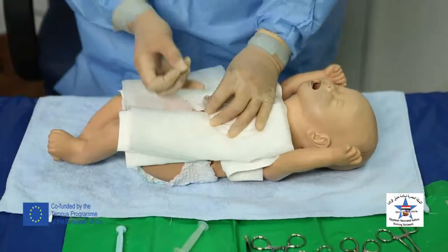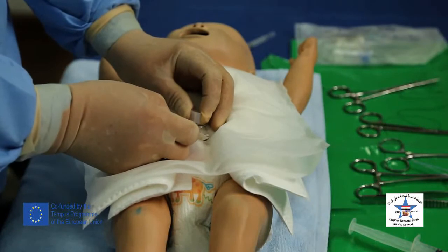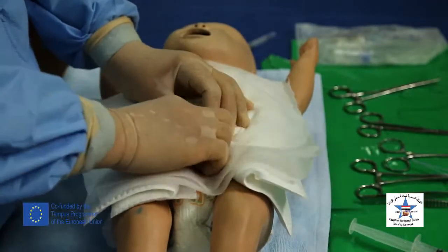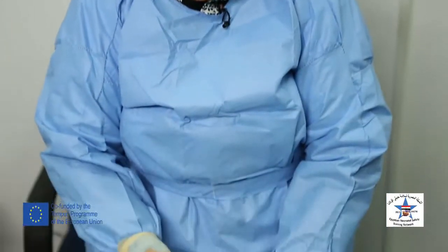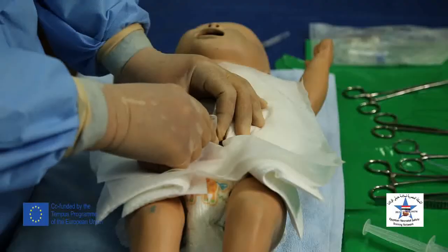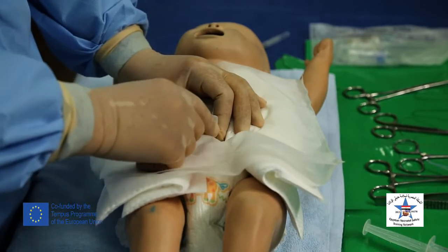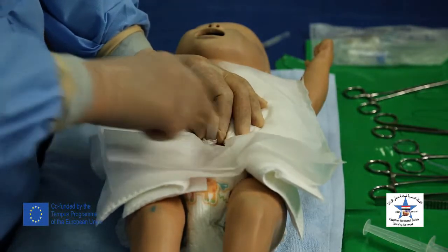And with the knife, cut the umbilical cord 2 centimeters from the abdominal wall. Identify both vessels, artery and vein, at the cut umbilical stump. Usually the vein is thin-walled and widely opened, located at approximately 12 o'clock position. The 2 umbilical arteries are thick-walled, pinpointed, protruding from the umbilical stump.